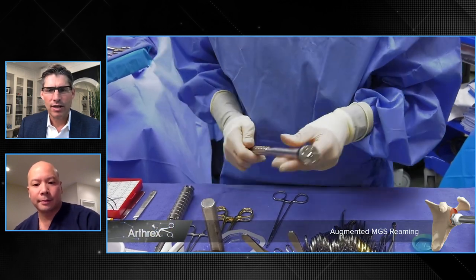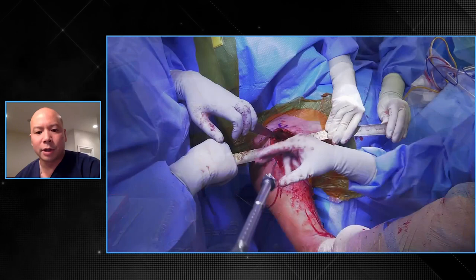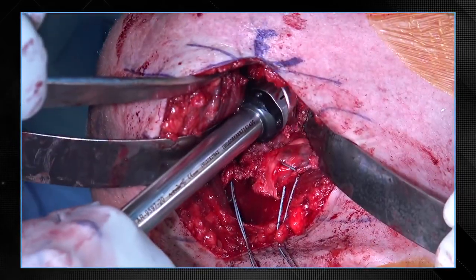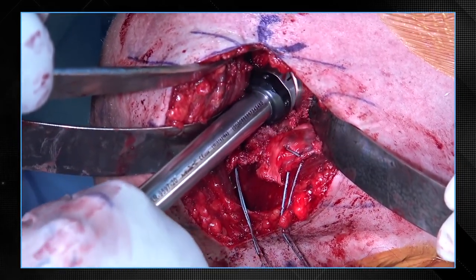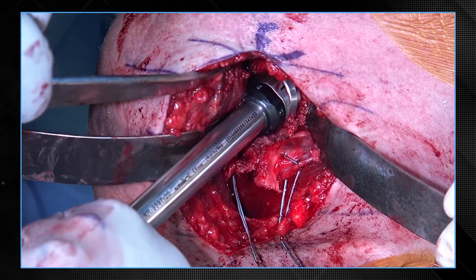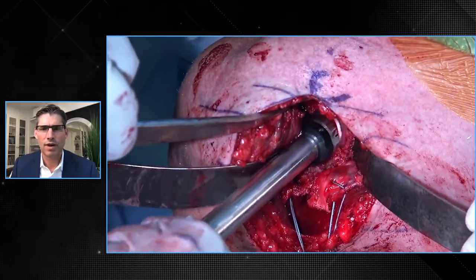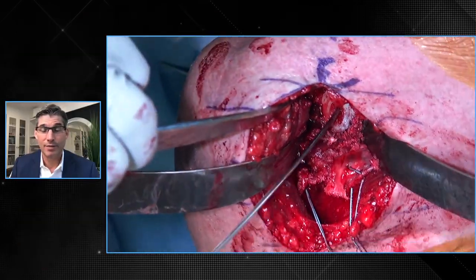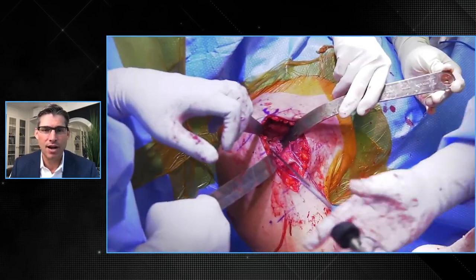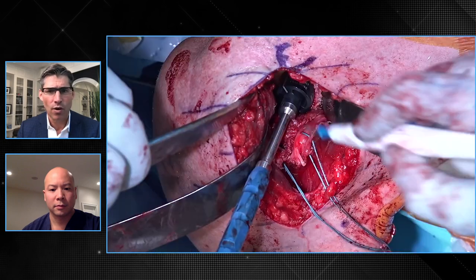Now it looks like you're about to ream. This reaming system is really nice — why don't you describe it as you go through this step? This reamer is very low profile, so it allows you to get into tight spaces, and it's reamed at an angle — basically a wedge to accommodate the bone deficiency in the base plate. My right hand is stabilizing this so that when I ream, I can maintain the position I want to maintain the clock-face orientation for the augment. That fits in there easily. Now it looks like you're checking again with another template or guide to make sure your augment is oriented the way you want — exactly. This guide just allows me to check and make sure that it's shaped the same way as the base plate, to make sure that it'll accommodate the base plate in the way we reamed.